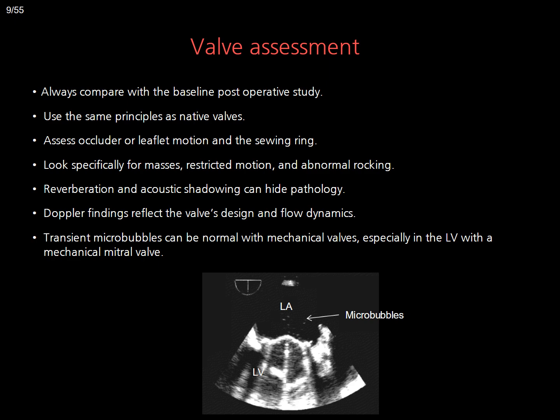Remember that reverberation and acoustic shadowing are expected, and they can obscure key areas. That is why you should sweep through multiple views and optimize gain and depth. Keep in mind that each valve design generates characteristic flow patterns that shape the Doppler profile.